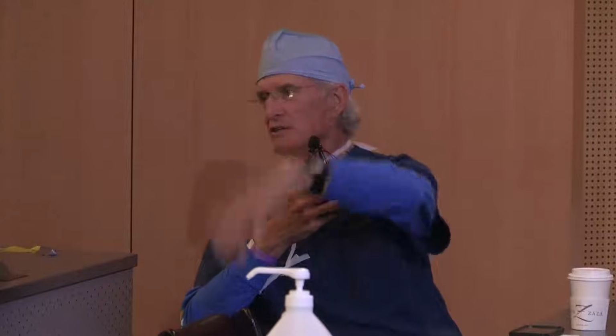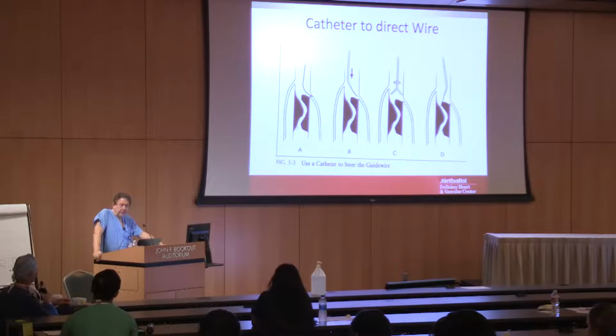If you mess around and you see you've got bleeding, now the balloon is off the wire, your instinct is, grab me a covered stent, they're running out in the back room, patient gets hypotensive, next thing you know you've got a big retroperitoneal bleed, it changes everything. So your initial response, put your finger on the hole, meaning inflate the balloon. And the one thing you can't do is lose the wire in that situation.